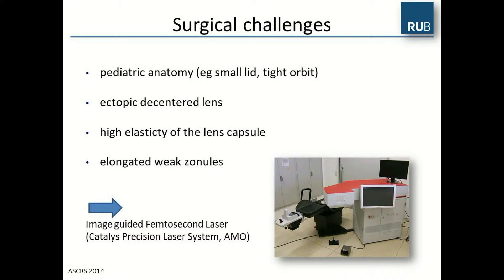We decided to perform the surgery with the help of the image-guided femtosecond laser. Our system is the Catalyst precision laser system from AMO.